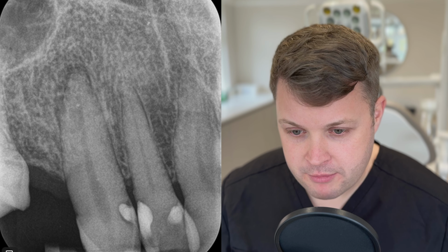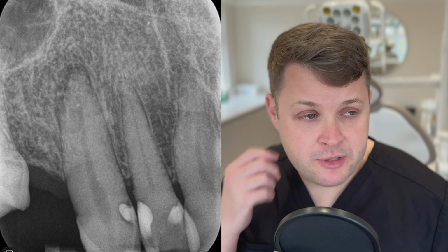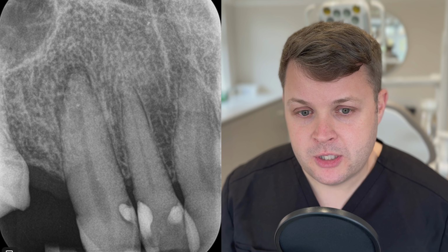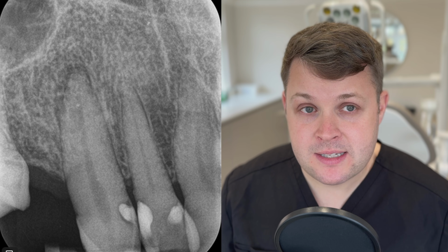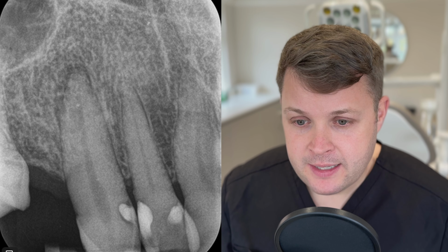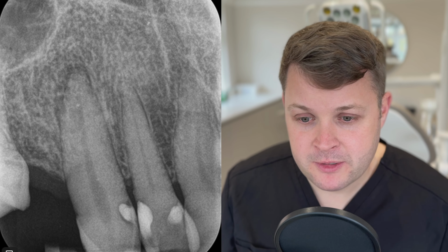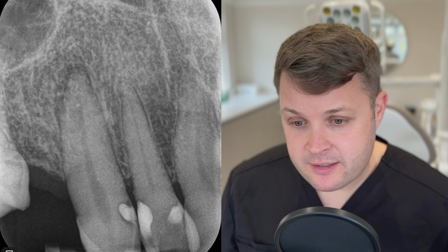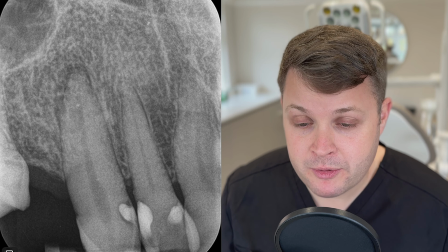So this is an upper right 3, and straight away when I had the consultation for this person, I noticed that the patient was exhibiting signs of irreversible pulpitis, and also a chronic or an acute periapical periodontitis. And when I was looking at the tooth, I didn't understand why this tooth had died off. In fact, when we took the periapical radiograph, we can see here that in the mesial aspect of this tooth there's decay, but also there's an obvious apical area around this tooth.